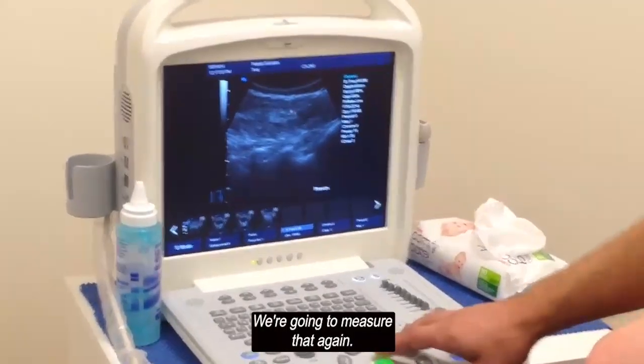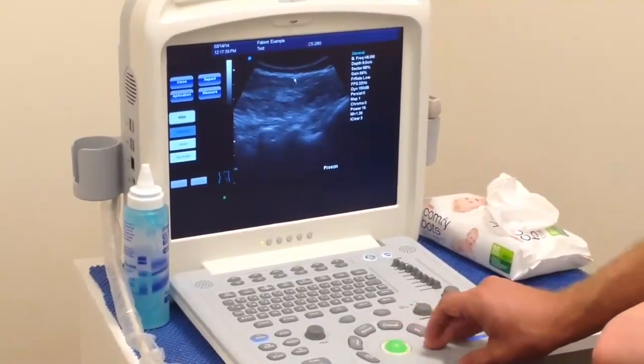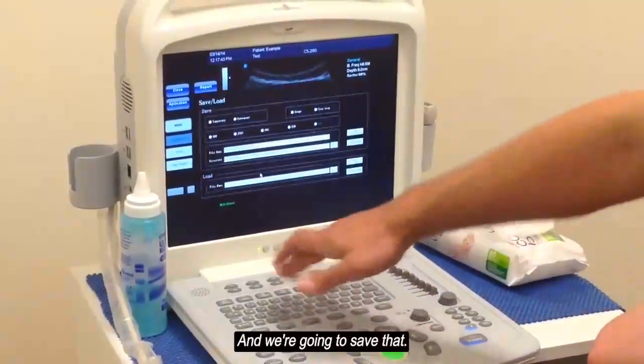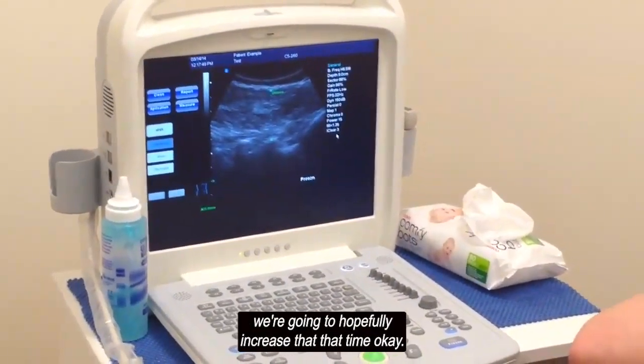Okay, we're going to measure that again. And we're going to save that so we've got that for our records. Because as we do some training, we're going to hopefully improve that over time.